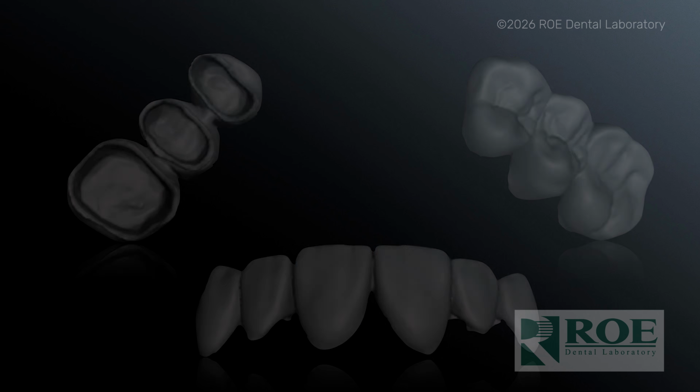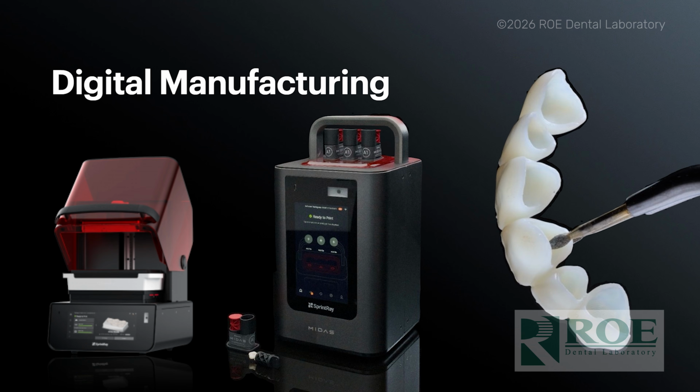So that was the first 2 steps: digital imaging, digital design. The last step is our digital manufacturing. Oh my gosh, that's the best part because it's so much fun. So how do we do this? Well, once you have the design, you're on easy street. So you can either design this with digital press stereolithography. That's something like the Midas. My printer just went off behind me if you heard that. Or you can use a 3D printer, which uses resin. Either way, I'm going to use the same resin in my practice.